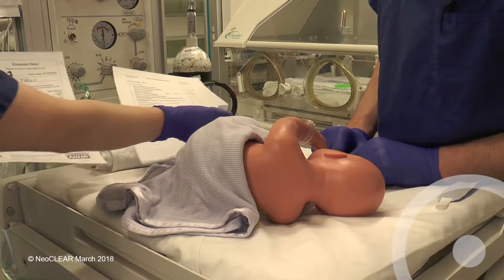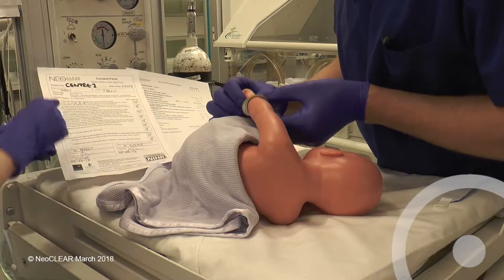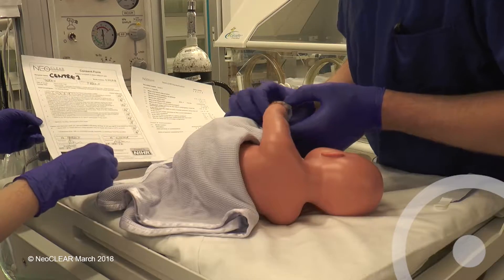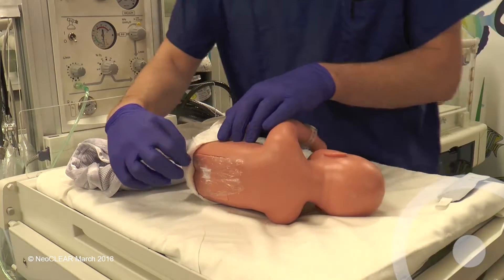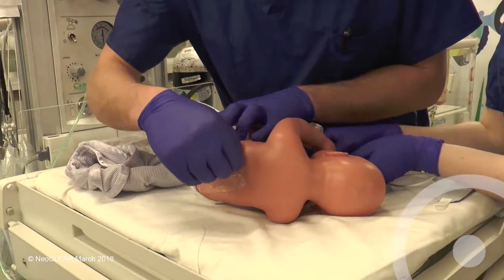Before starting, check the consent form and bring the printed allocation from randomisation. Confirm identity and allocated technique with the assistant. Assistants should wear non-sterile gloves. The area should be warm and well lit. Term babies should have had local anaesthetic cream applied. Remove this and clean any soiled skin with water.